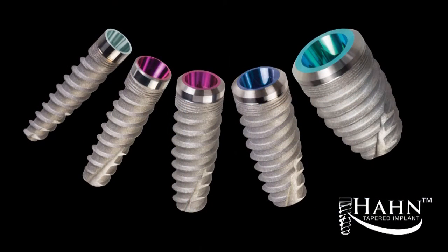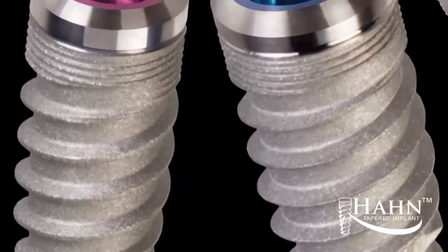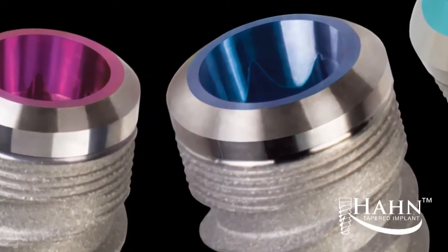This illustrates why the Hahn tapered implant was the ideal selection for this case. The tapered body of the implant is suitable for tight areas and sites where aesthetics are important. Its prominent buttress thread and widened apex help establish excellent stability in all bone types. The dual lead thread pattern and self-tapping grooves allow for swift insertion, and the coronal microthreads aid in the preservation of crestal bone.